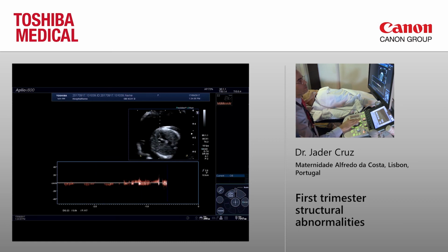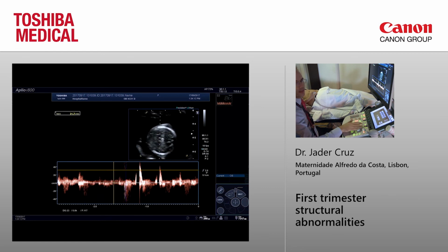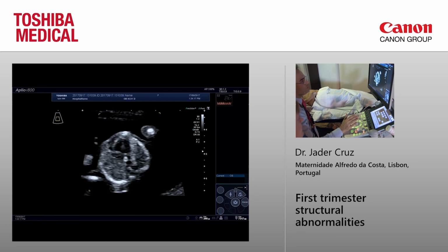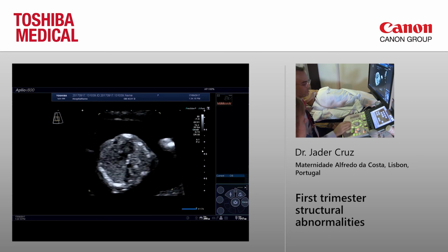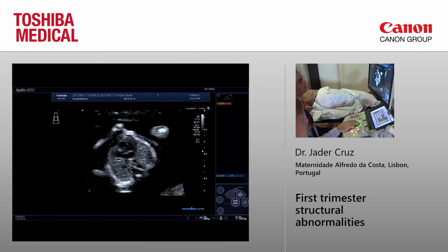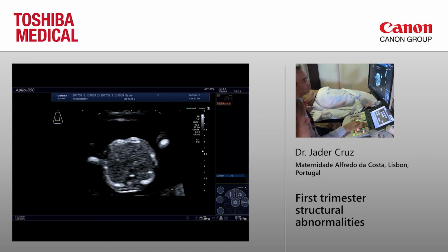And that's the tricuspid there. You don't need to use the color, you just need to place in the right place. And what you try to do is to sample across the valve. You start close to the septum, and then you move along the valve just trying to get all the valve, to assess all the valve.